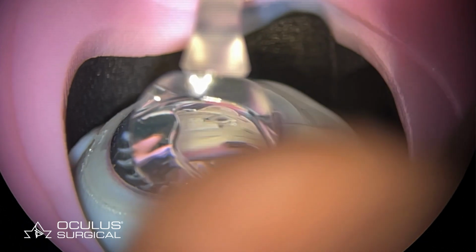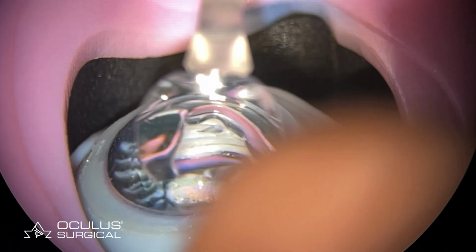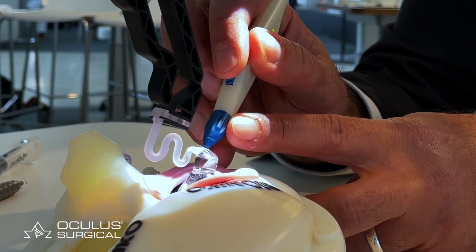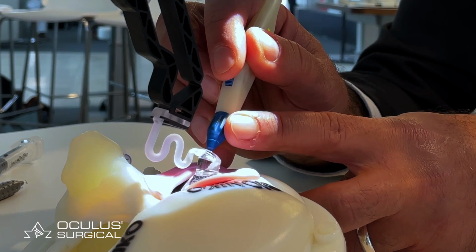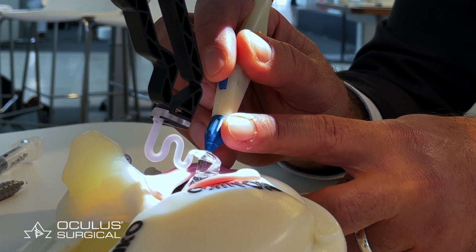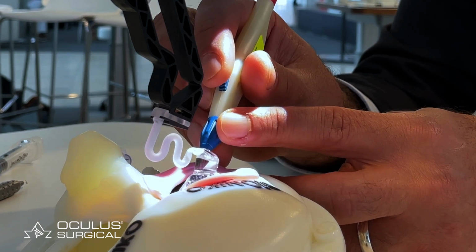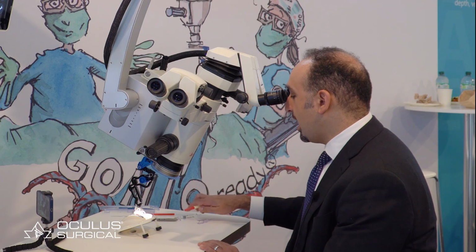Roll the tracking wheel. You can see how great the control is that I have when using the Hydrus in such a confined and fragile space, because again, I'm not using my non-dominant hand for the gonioscopy lens. I'm using my non-dominant hand here, my left hand, to stabilize the Hydrus. Just to show you that, you can see I have two hands on the Hydrus. My left hand here stabilizing, and then my right hand rolling the tracking wheel forward, which I think gives you that excellent control.